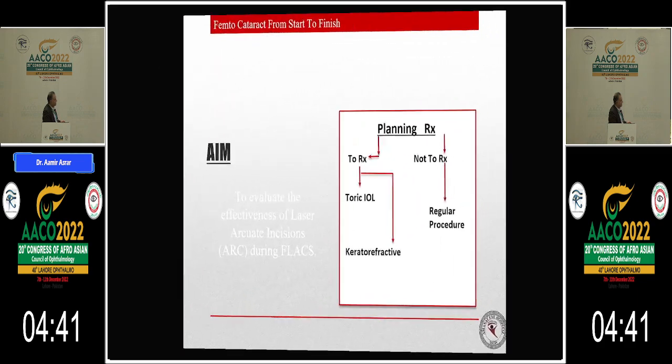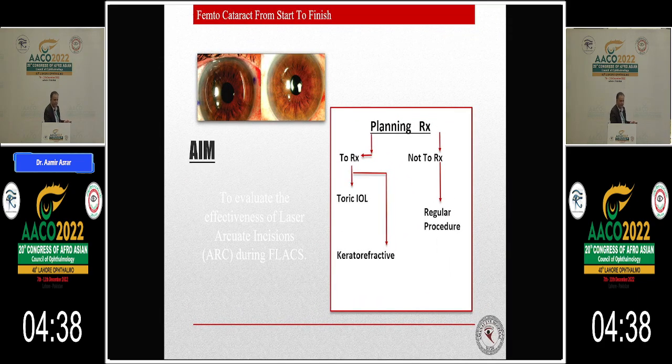There are different reasons why people are not using femtocataracts. The study that we did was to plan the treatments, and the planning was whether to treat the astigmatism with toric IOLs or with keratorefractive surgery with femtocataract, or not to treat them.